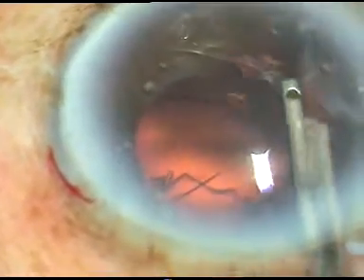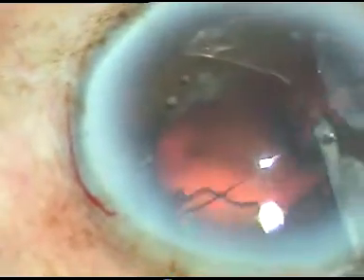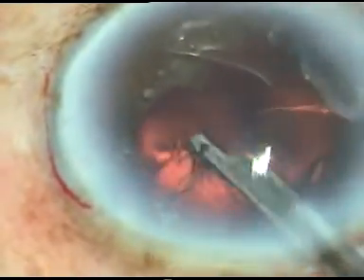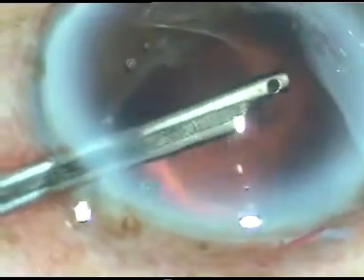If I don't remove it, it can get lost underneath the iris, and after one month you may notice it at 6 o'clock in the anterior chamber. To avoid that, we must take out any small nuclear fragment before aspirating cortical matter. In this case, the cortical matter has been removed by a Simcoe cannula. I am going through the side port and have removed the cortical matter.